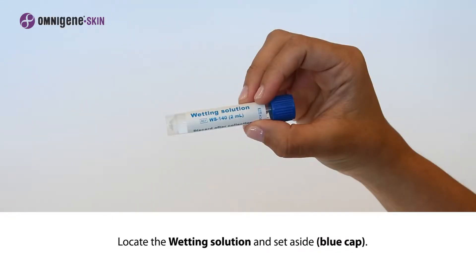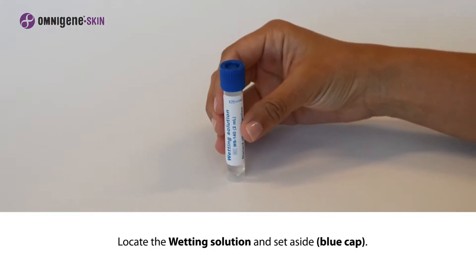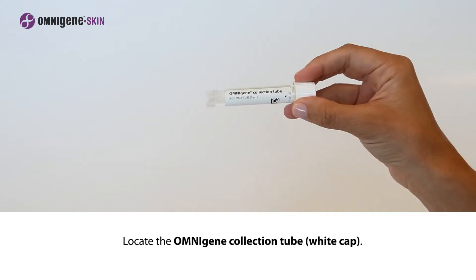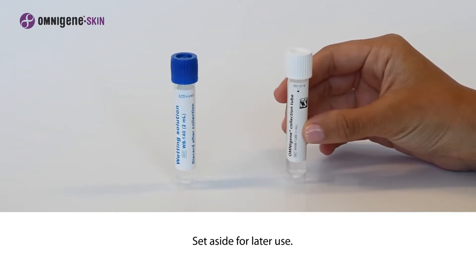First, locate the wetting solution with the blue cap and set it aside on a clean surface for later use. Locate the Omnigene collection tube with the white cap and set it aside on a clean surface for later use.